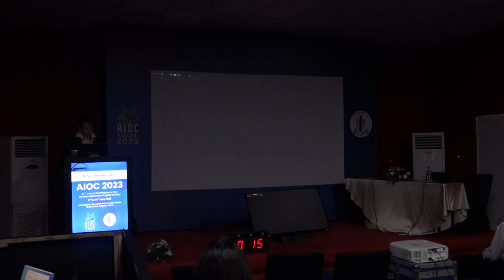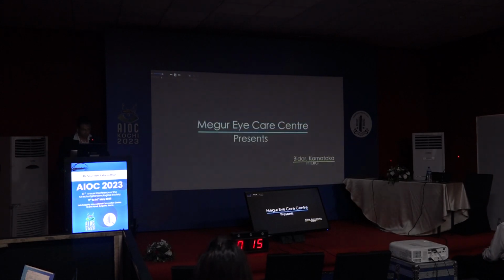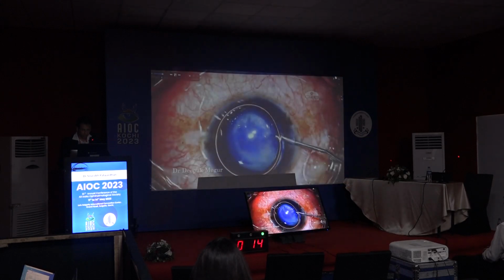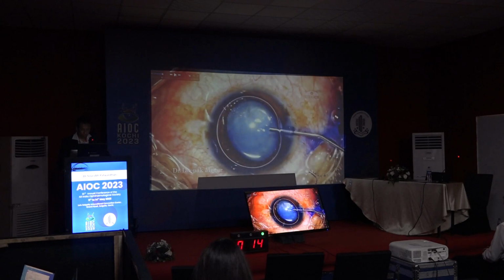Dr. Bide, thank you for the opportunity. Dear friends, I'll be speaking on management of subluxated cataracts, and the theme of the session is what will you do for this case. He is a 65-year-old gentleman who presented with this intumescent cataract, but also has this 4 o'clock hour zonular dehiscence. So we have got multiple challenges to deal with.